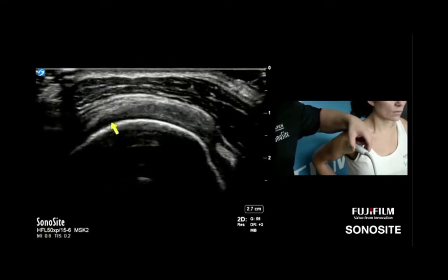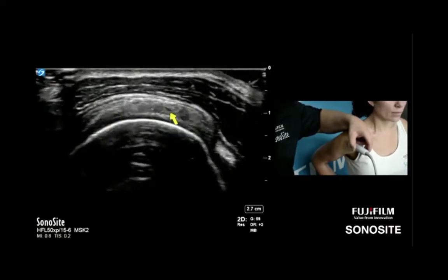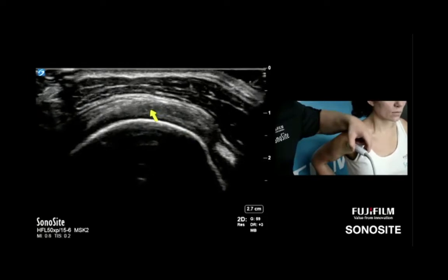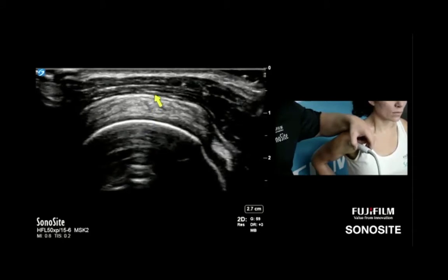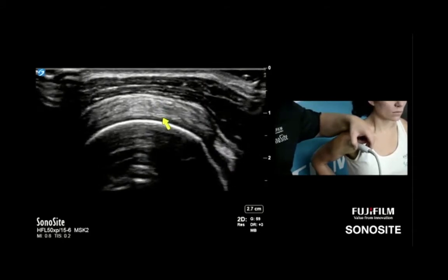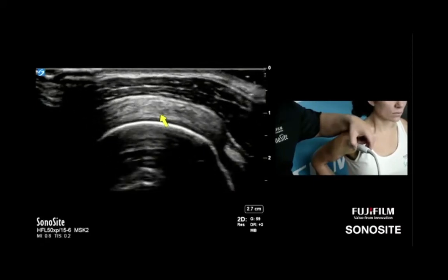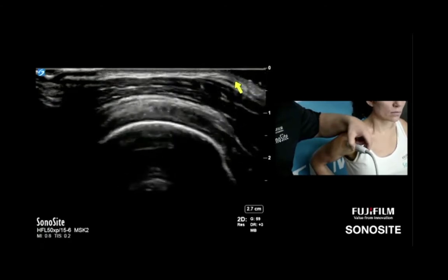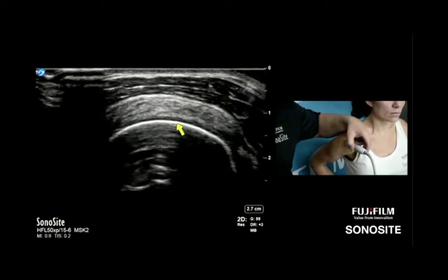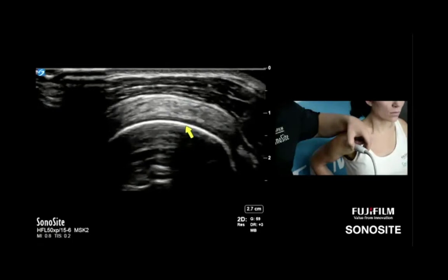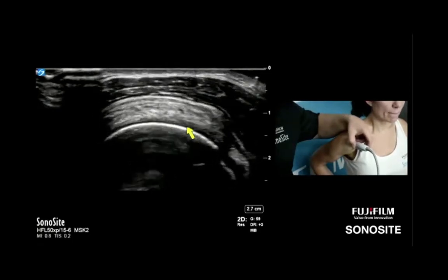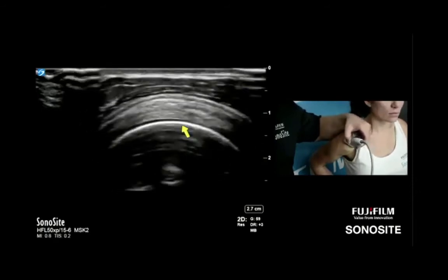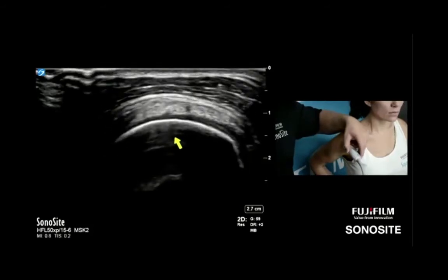This is the equivalent of a wheel and tire. We have a properly inflated tire. If I had a flat tire — from the top surface or underneath — there'd be volume loss, it would be compressible. You can tell whether the pathology is bursal or articular in nature. Notice I have gel in the upper corner of the image — that's good, showing I'm not collapsing useful pathology. You do not want to collapse little partial tears; they will show themselves with very light pressure. I scan as proximal as I can until I hit the coracoid or acromion, then come back until I see the enthesis at those facets.